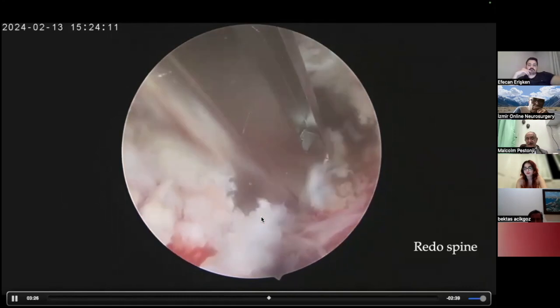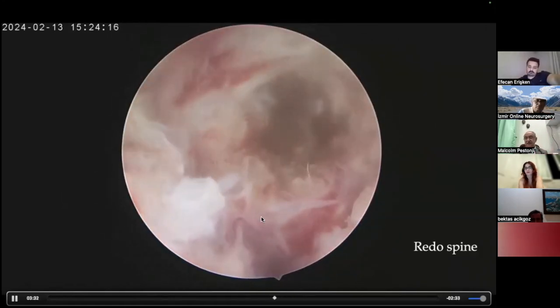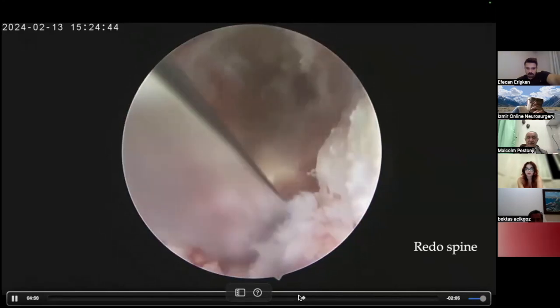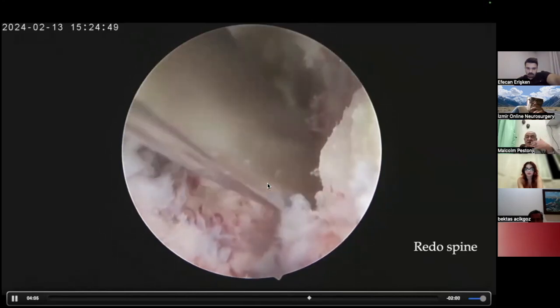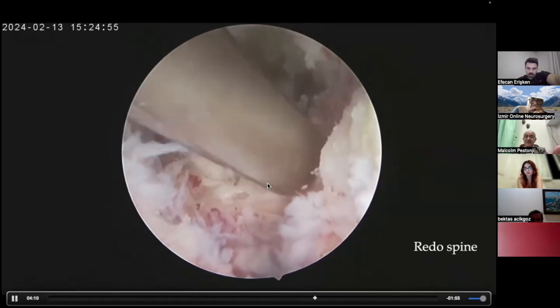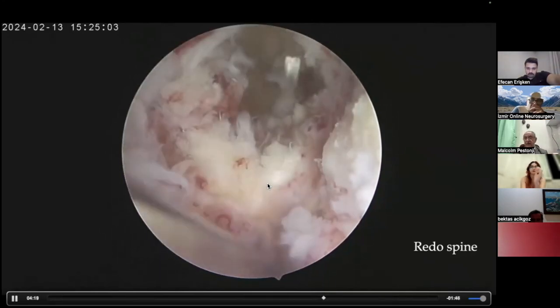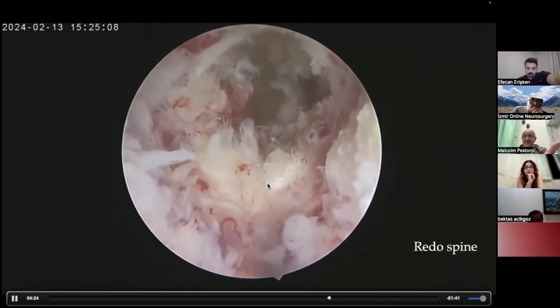When my cage went in, I had a further lateral herniation of disc from underneath and behind my cage. See this. As I push the root away, see the disc bulge that was there. Oh my God. So I had a bulge that was beyond and bigger than the cage itself, the cage which has backed out. And this disc was elevating the root. Why should this patient not develop a progressive neurological deficit? So the cause was multiple. Not that the cage itself was causing so much pressure. It was this disc.